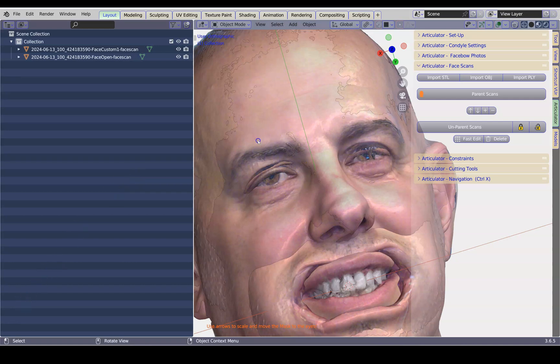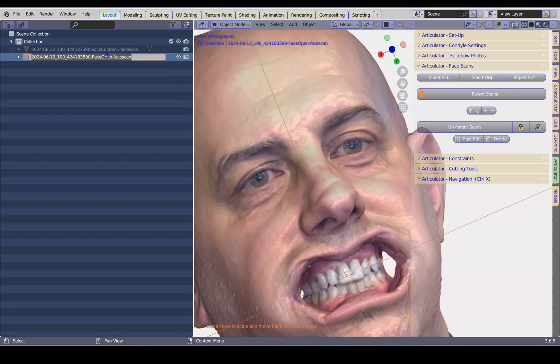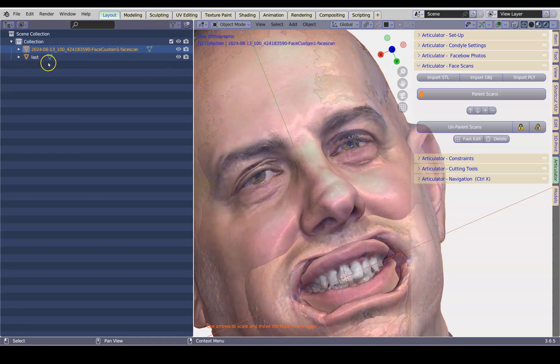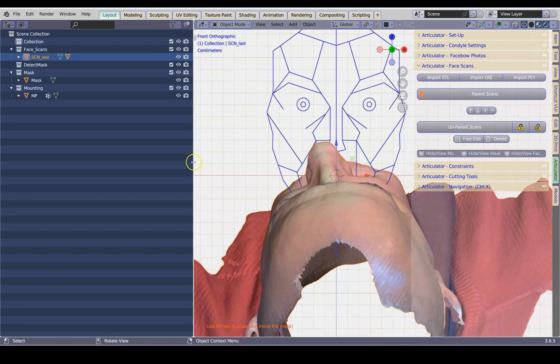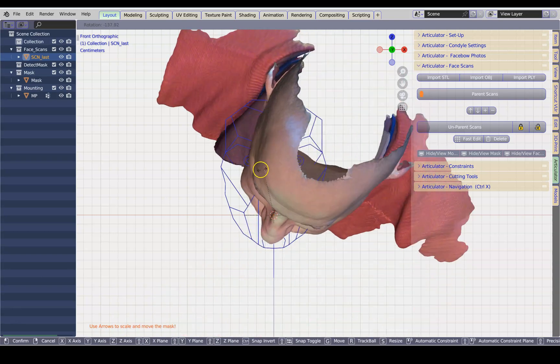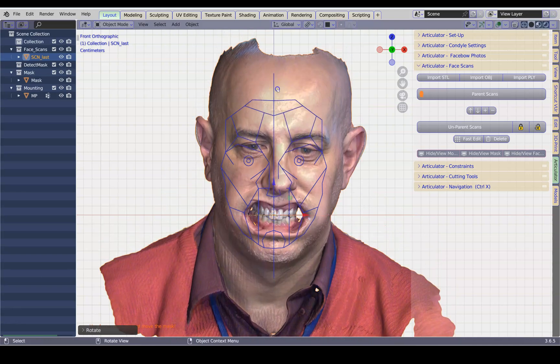It is always beneficial to do object management. We need to select the one that we need for ICP alignment last, so I'm going to call this one 'last' just so that I don't get confused. I'm going to left-click and then hold Control and left-click — you'll see this one is orange and this is dark orange, depending on your theme. We're going to parent the scans, which means the parent is visible and the child is not visible. We are looking at this from the front, so all I have to do is R to rotate it, then RX to rotate it and bring it in line with the mask.